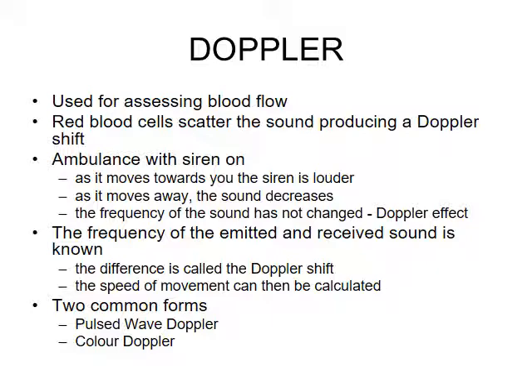So as I said, in ultrasound, what we use Doppler for is mostly to look at blood flow within the vessels. So this time our transducer is standing still, but what's moving are the red blood cells within the vessels. And so they move in relation to the transducer, so the transducer picks up a perceived change in movement in these red blood cells, and therefore we're picking up the Doppler effect or the Doppler shift.